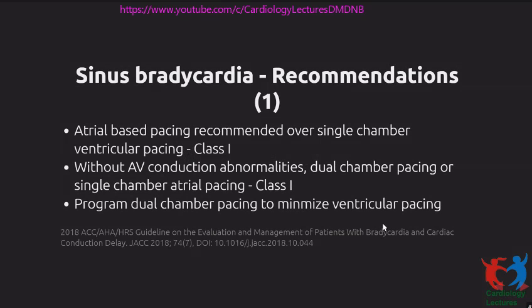Now, that covers most of the indications. We covered sinus bradycardia, complete heart block, and a few miscellaneous conditions, including reflex syncope, congenital heart block, post-MI block. And now, very briefly, I'll discuss a little bit about mode selection, because once you decide that you want to put a pacemaker, the next decision is what pacemaker to use. For sinus bradycardia, I'm mostly following the 2018 guidelines for recommendations, but I'm going to tell you more of personal experience and what we practice.